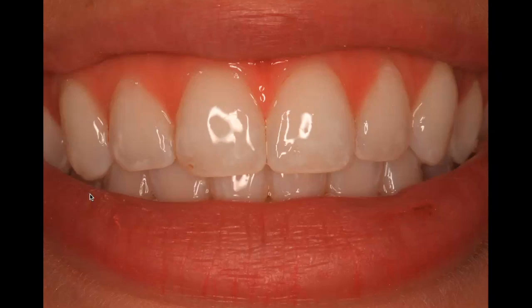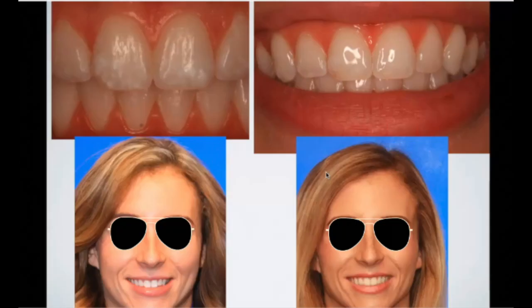All right, so after you access as much as you can, then you'll actually infiltrate it. And you can see here, this was the area that we didn't feel like we were going to be able to access, so we just left that. You can see here there's some deeper areas as well. But overall, you can see that as we place the monomer on there, it's filled in the teeth pretty well. So this was the before and after smiling photos here.